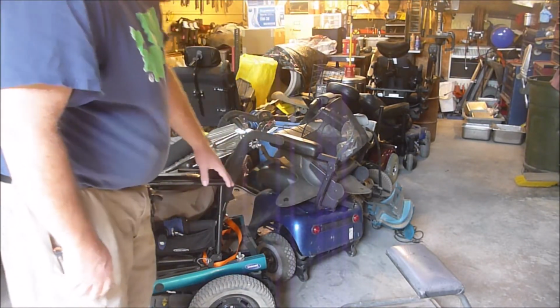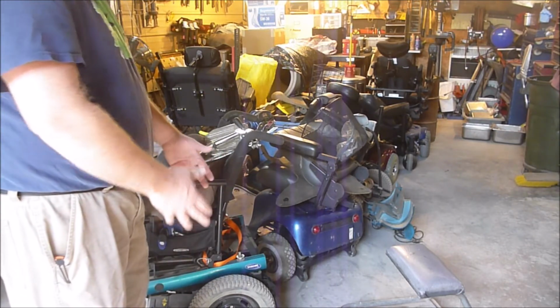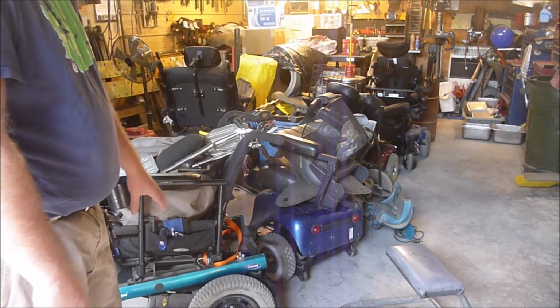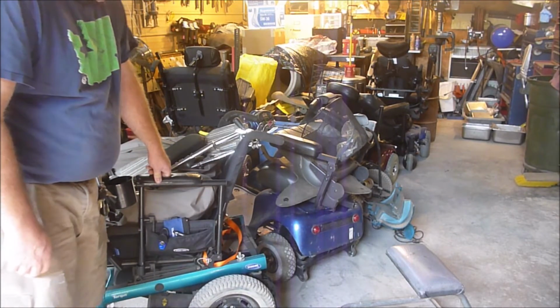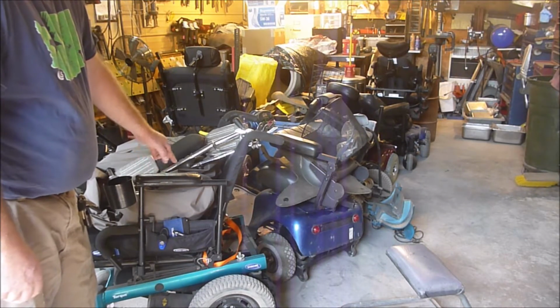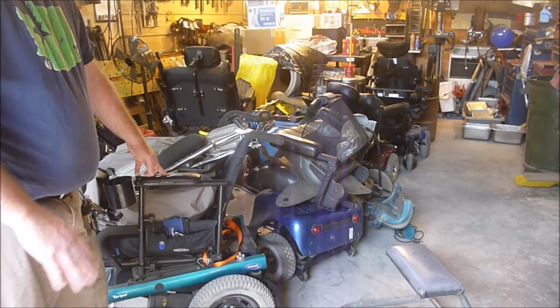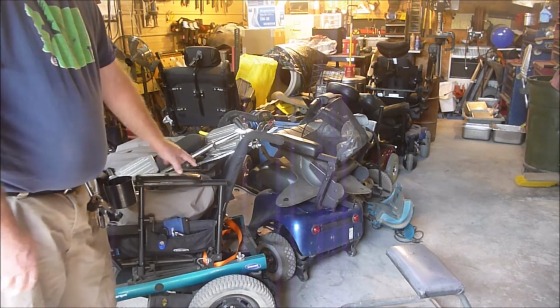It takes two 12-volt batteries. I don't know what size, I just went and bought them. They're not a normal car size battery, they're slightly smaller, but not much. So this one will go quite a while. The batteries I had on this, I originally got with the chair, and I've had this chair going on 8 years now. I just replaced those batteries because they're not holding charge as long as I would like them to. And to push this thing around, that's the one thing.